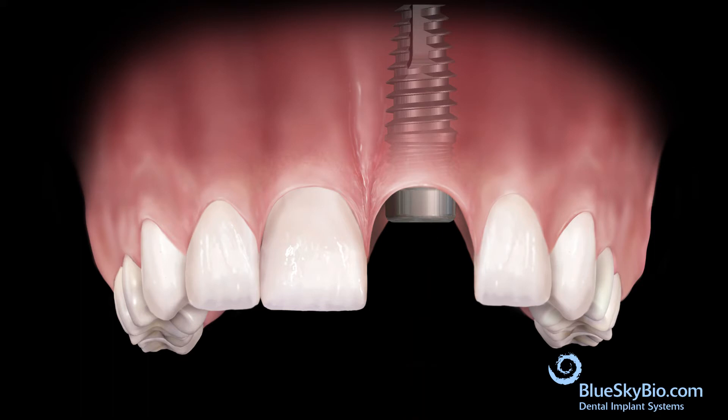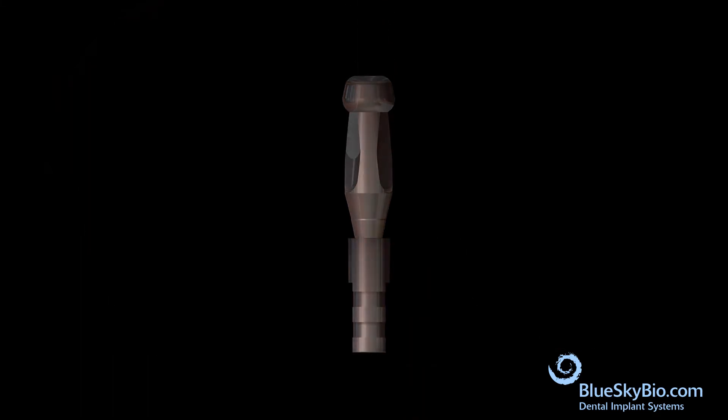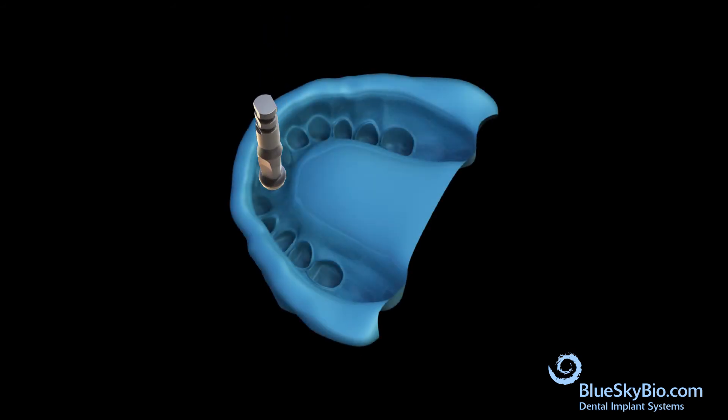Attach the impression transfer to an analog. Orient the impression transfer and analog assembly so that the flat surfaces of the transfer match the flat surfaces in the impression, then fully insert into the impression.